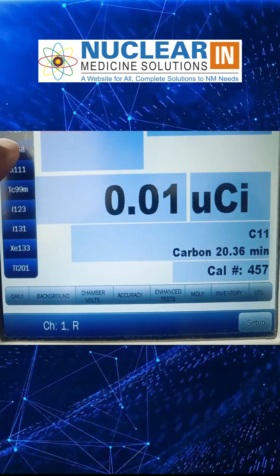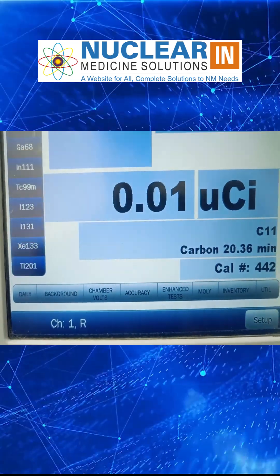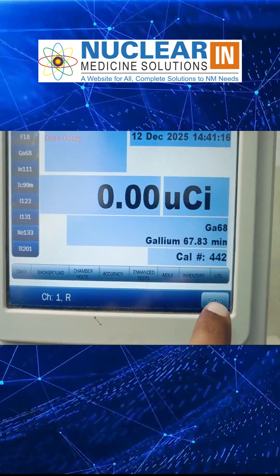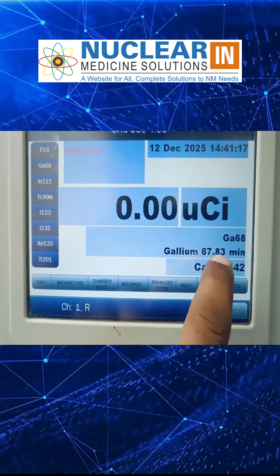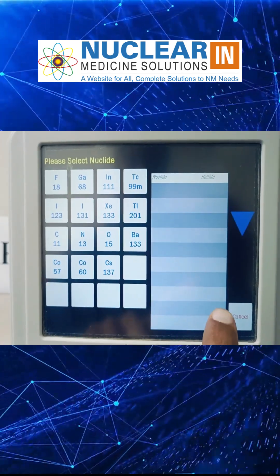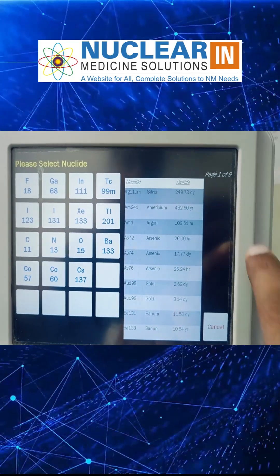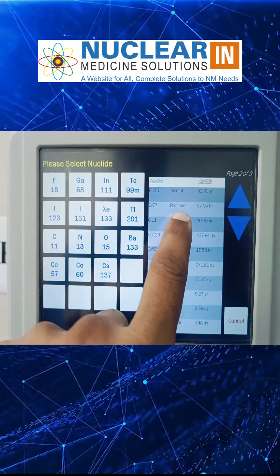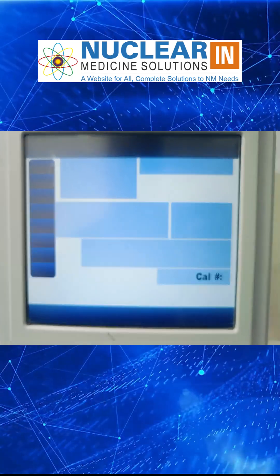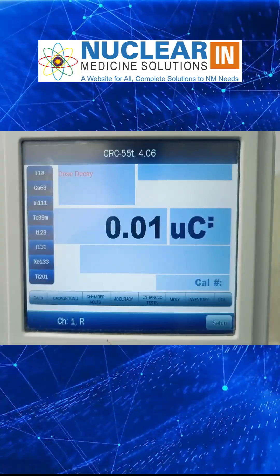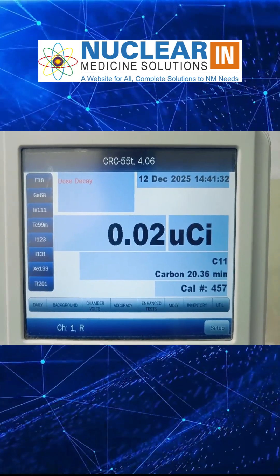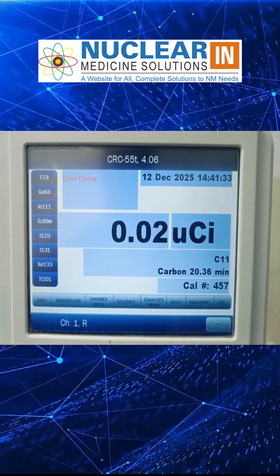Whereas when we clicked Gallium-68 it was 442. So now if you want to change for C-11, we just go there, click on this arrow, select C-11, click Accept, and it will apply the change for C-11, and we can measure with C-11 also. Thank you.